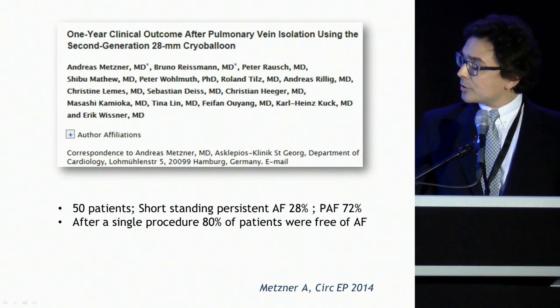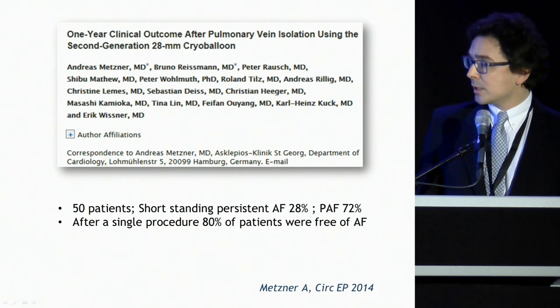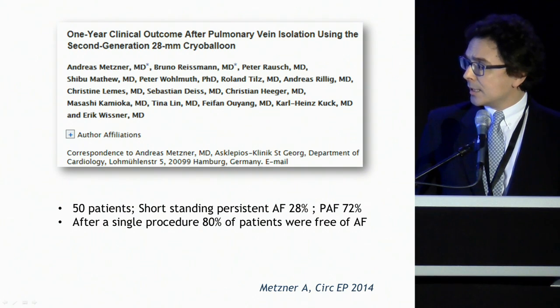This data was actually confirmed by the Hamburg group. In this case, they also included early persistent atrial fibrillation, about a third of their patients. And after a single procedure, 80% of these were free of atrial fibrillation.